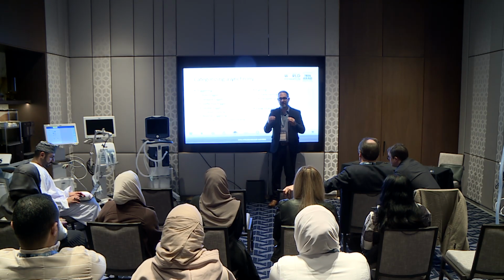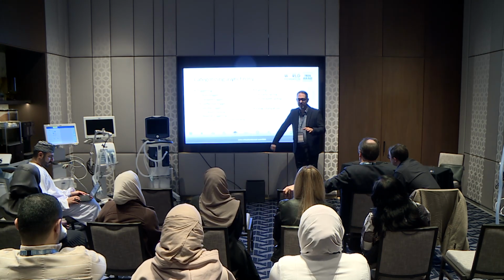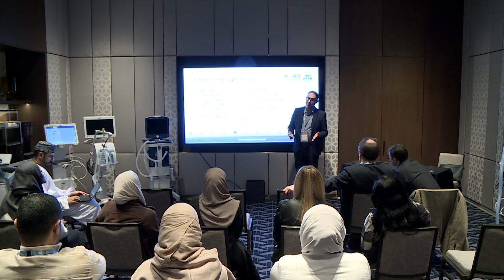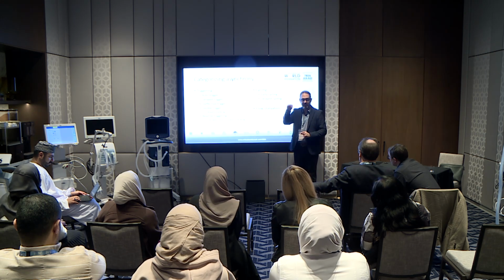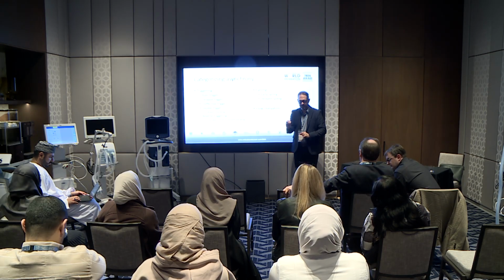I'll teach you how to identify reverse triggering. And again, how I'm going to teach you is without fancy tools, which means someone could disagree with you and say, well, the way that we confirm asynchrony is esophageal pressure, which we mentioned, or EDI, electrical activity of the diaphragm. That's how you can be certain what you see is asynchrony.